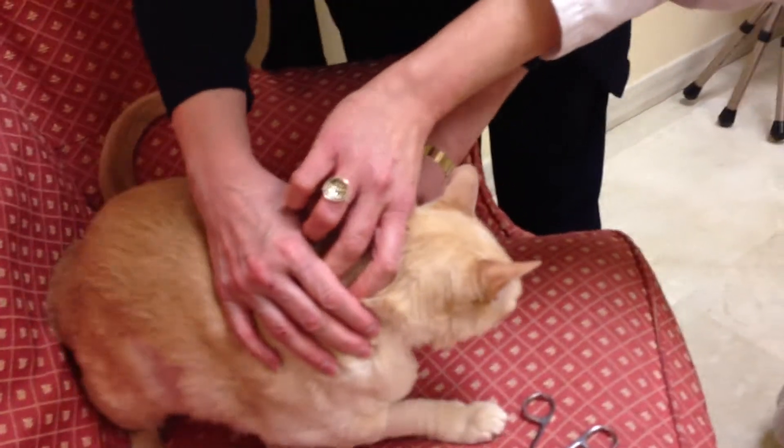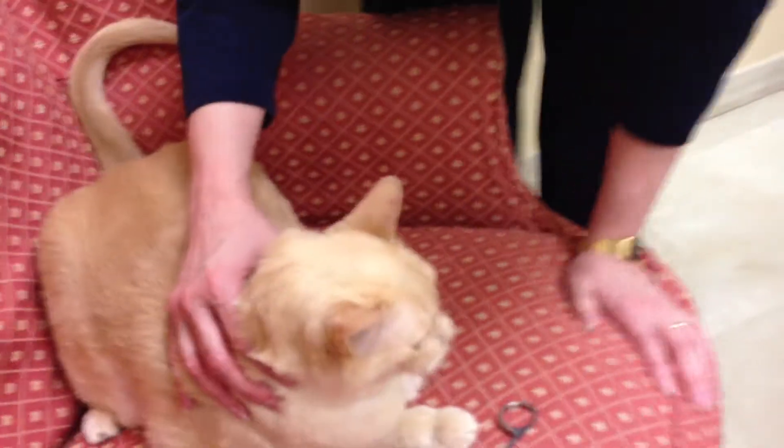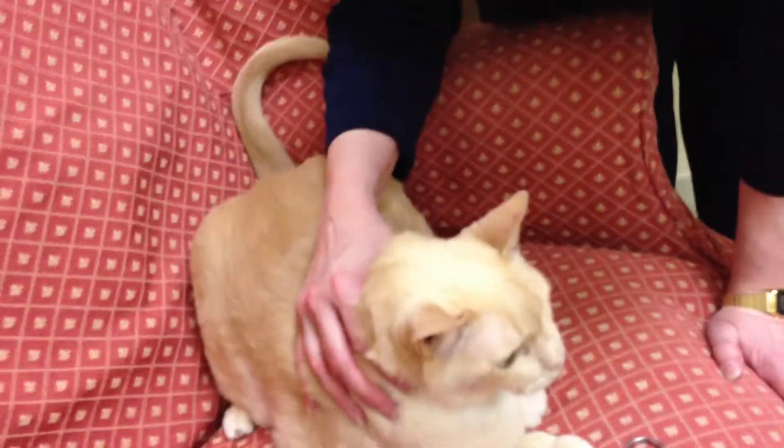That's so good. Do you mind holding that in place? And I will just get a little bit of antibiotic ointment. Don't you feel better? Good boy.